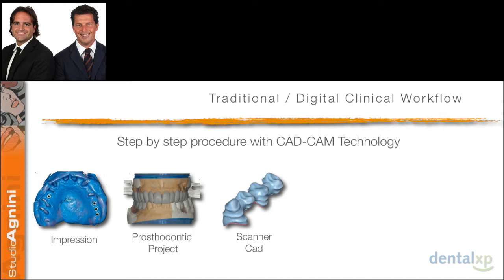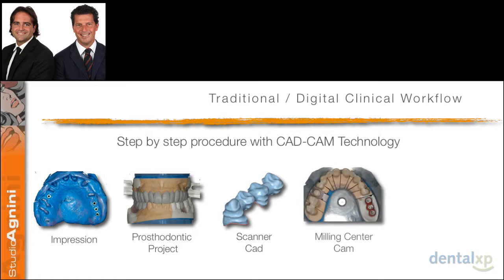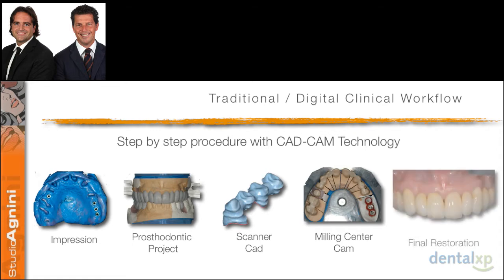Once he is okay with the framework design, he sends the file to the milling center, and the milling center will send us back the frameworks. We will try the frameworks in. We will go to the bisque bake phase. If everything fits okay, and if everything looks good for us and for the technician, we can deliver the final restoration to our patient. So as I said, this is already the present. It's not something that is going to be the future. This is really the present.